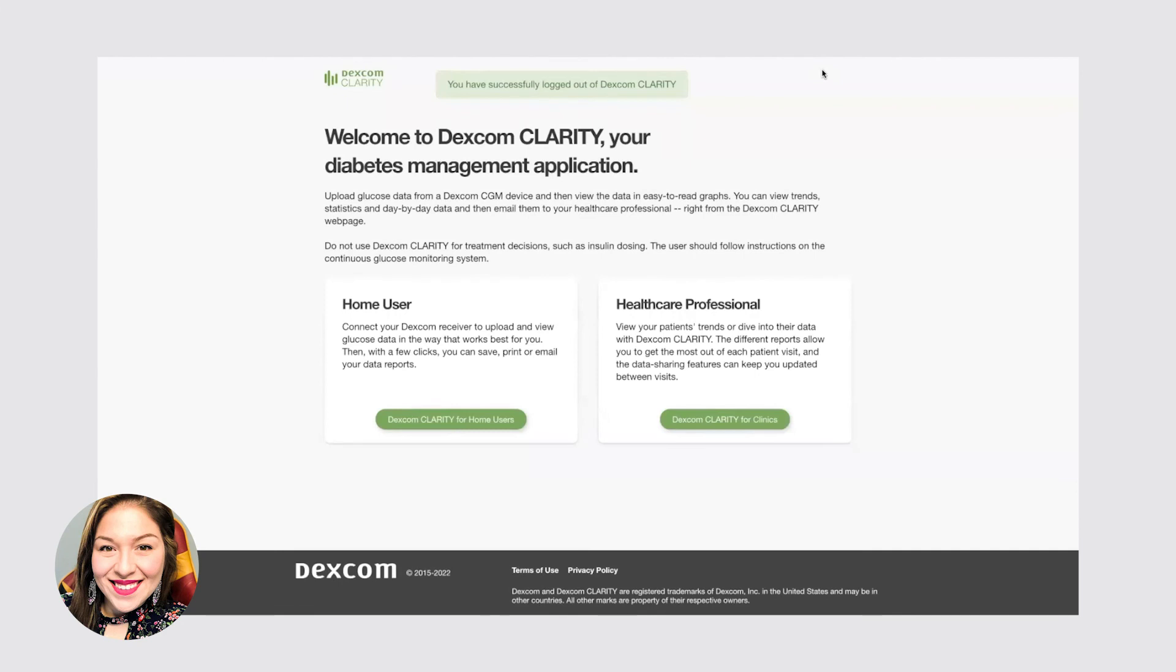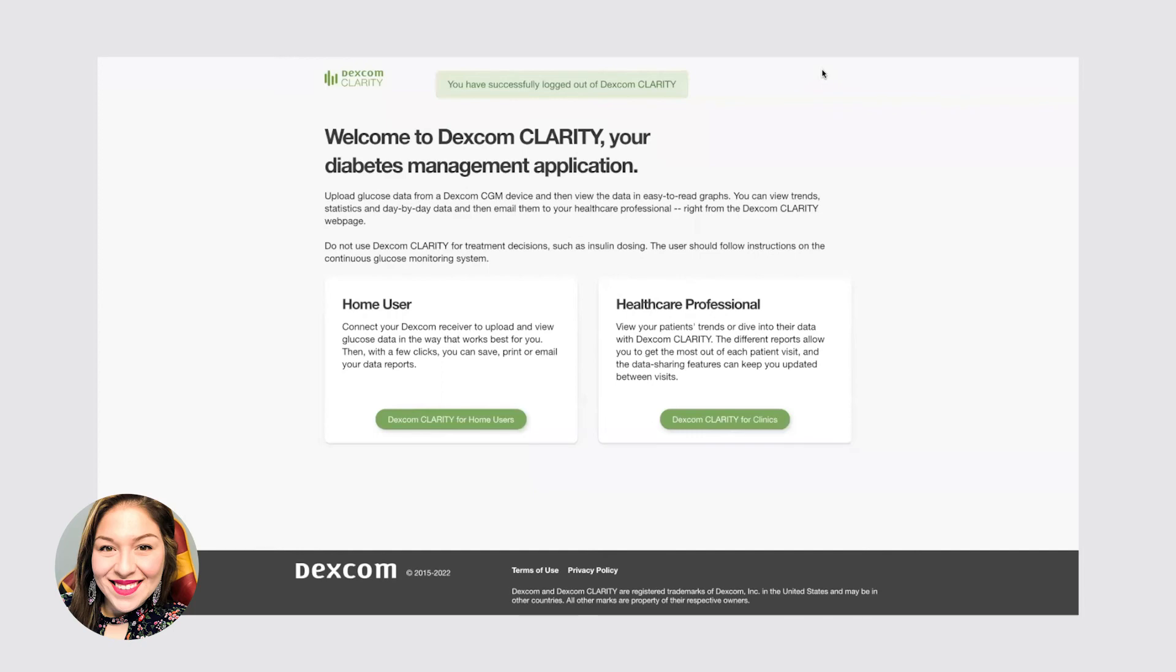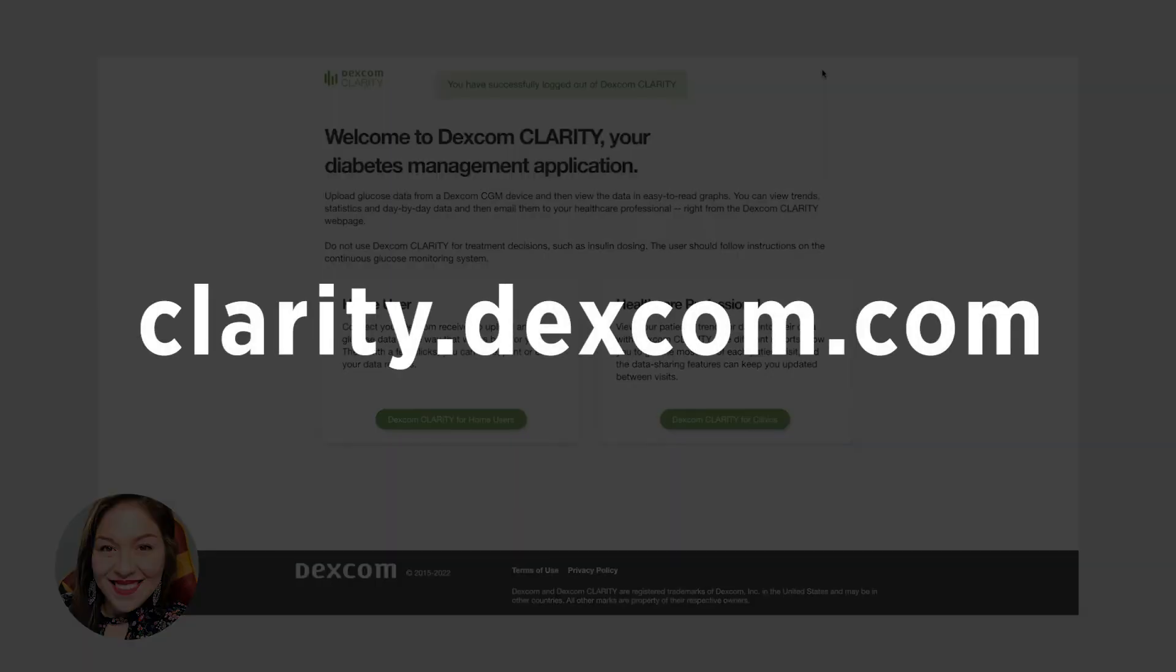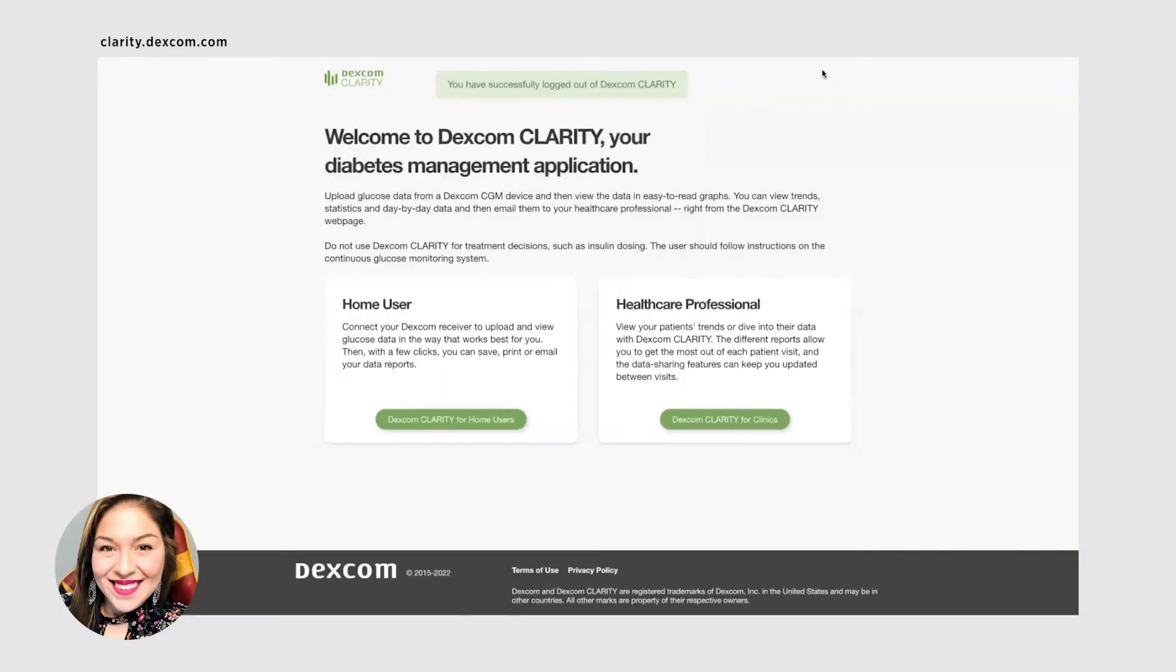The other app is the desktop app. So if you don't have a mobile phone, and if you use the handheld, you can still look at your past data. If you go online to clarity.dexcom.com. And so this is what the page looks like. And you will just log in as a home user.